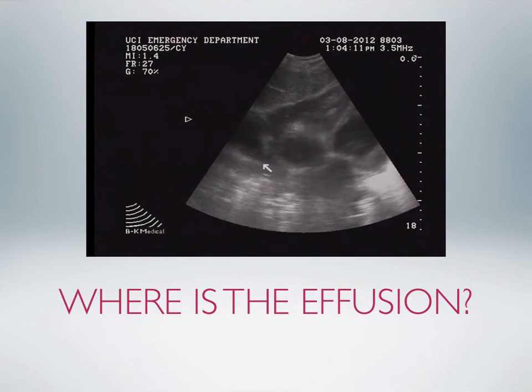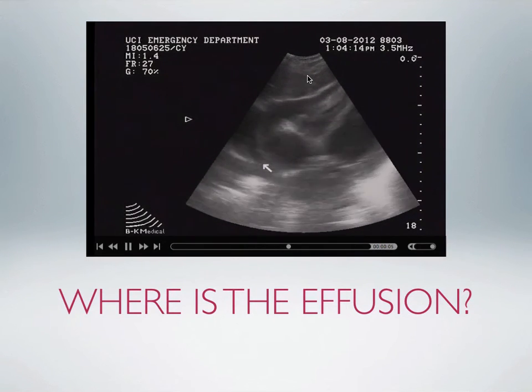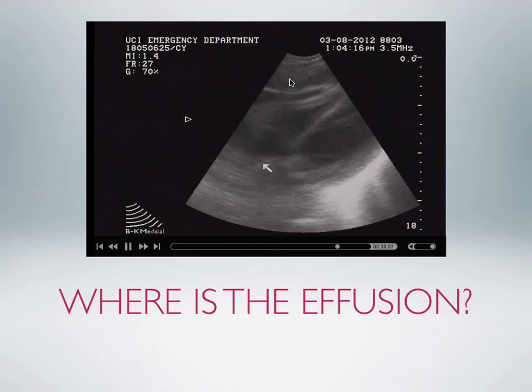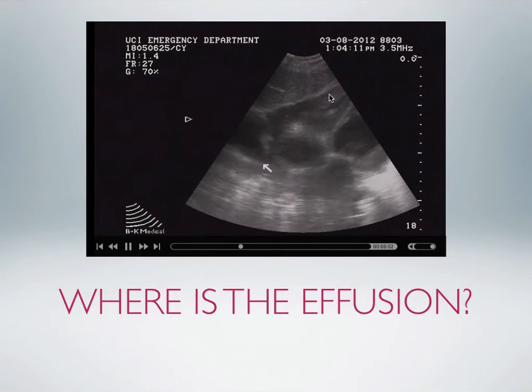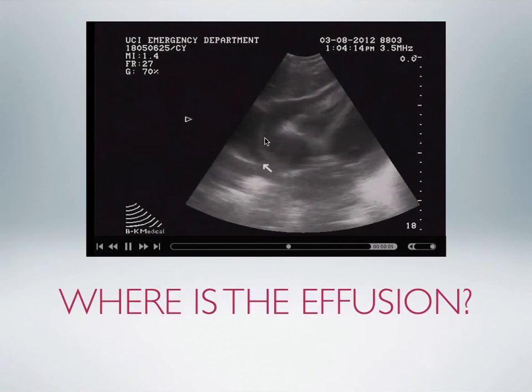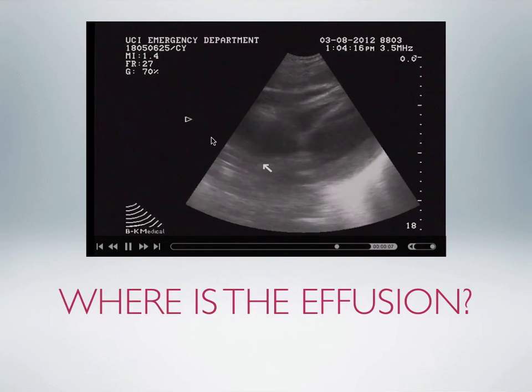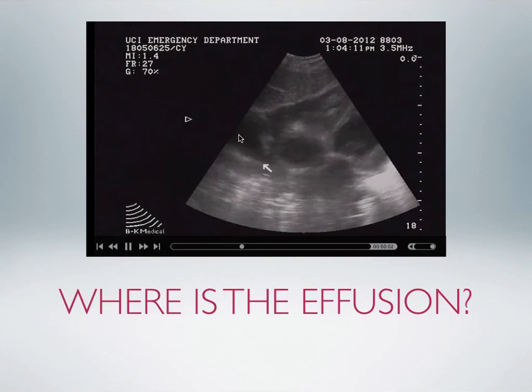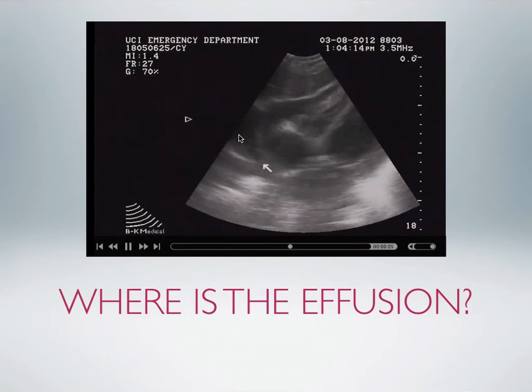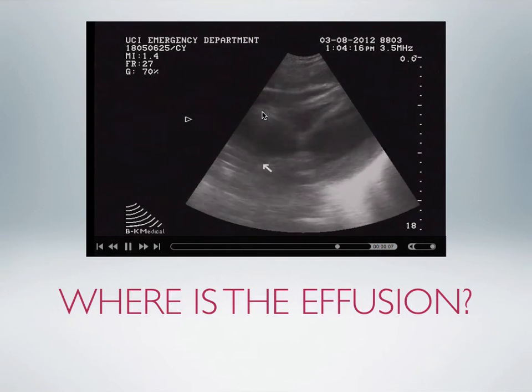Now the question over here is, where's the effusion? Subxiphoid view. We have the heart here, the liver here. We have the heart down here. There's a pericardial effusion over here. But there's something out to the side of the heart over here. Well, what's to the side of the heart? The lung. So this is a pleural effusion as well. So we have a pleural effusion and a pericardial effusion.